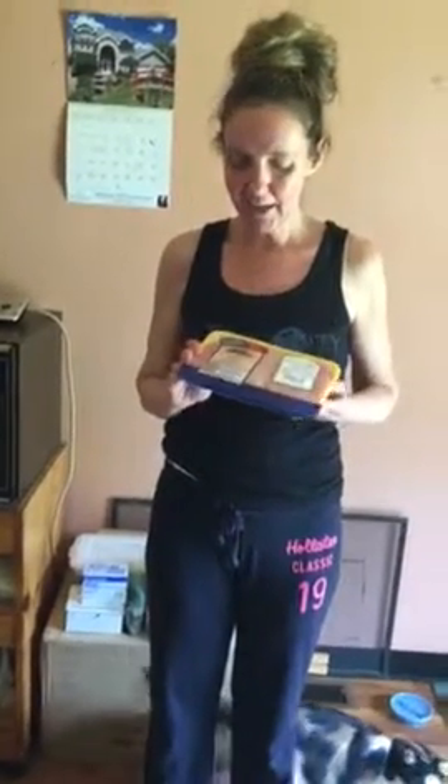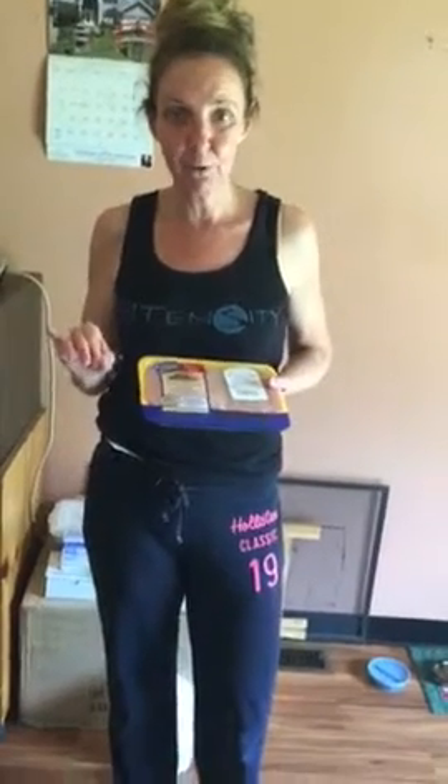Real quick, because I don't know how much memory is left on the phone, I wanted to show a couple of the new Feline Diabetes Message Board and Feline Diabetes Facebook page members how easy it is to home test even a difficult cat. This is followed by a video I did on how I conditioned my cat to home test, because she's not an easy cat to handle at all. My cat right now is in remission for her second time.